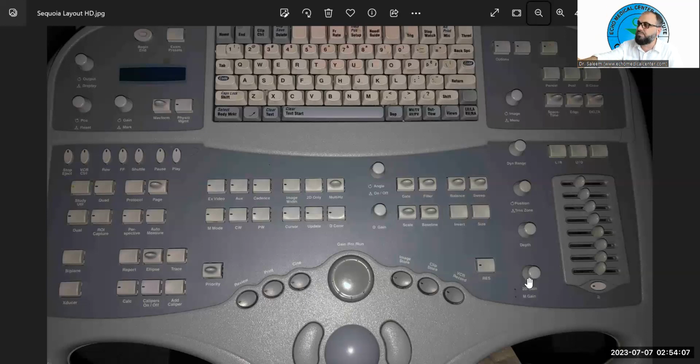So that is actually amplification. This knob is for amplification, to make a small amplitude bigger. But that's only for the reflection. When the echoes are coming back to us, it's not in a transmission mode, it's the reflection, the receiver mode, we can say. So that will be the 2D gain. And also, one more thing, these are TGCs. Other names for the TGCs are DGCs or SGCs. So TGC, time gain compensation, DGC, depth gain compensation, and SGC, swept gain compensation.